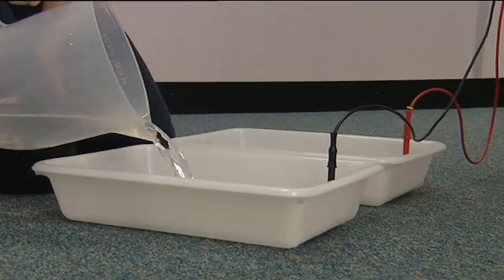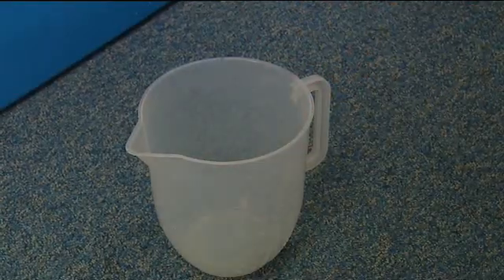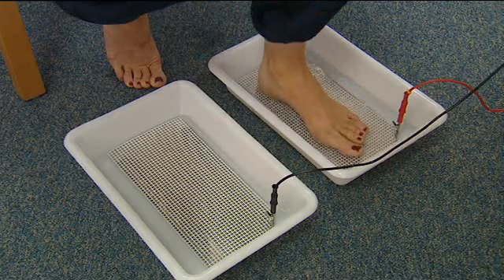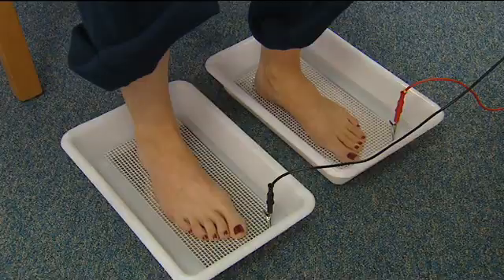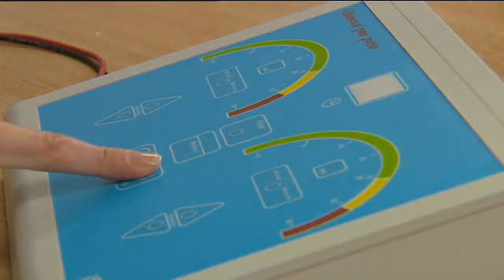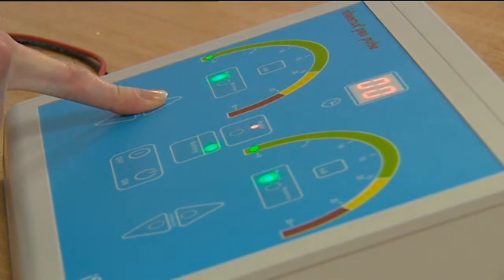When the feet alone are treated, the total time is 30 minutes — two sequences of 15 minutes. For the hands only, the treatment time is 20 minutes — two sequences of 10 minutes. When the hands and feet are treated together, the total time is 20 minutes — two sequences of 10 minutes. For treatment of the axilla, the total time is 20 minutes — two sequences of 10 minutes.